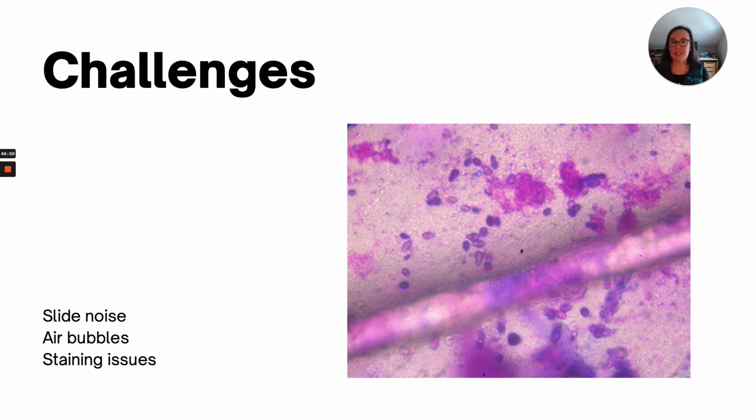And then if you don't see any yeast, sometimes I will actually go back and make an impression smear just to see if there's bacteria present, especially if I have a lot of primary lesions, like a lot of erythema, or something where the dog's heavily lichenified the area. Sometimes you need a backup impression.